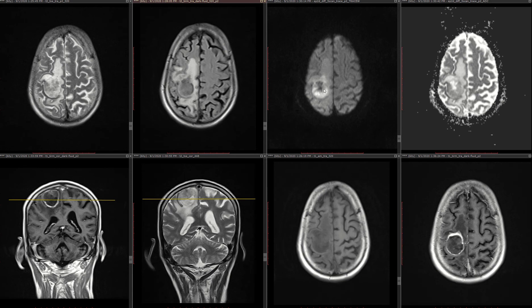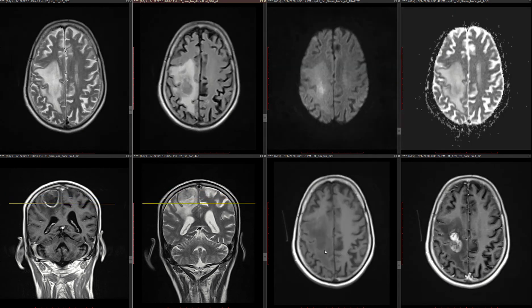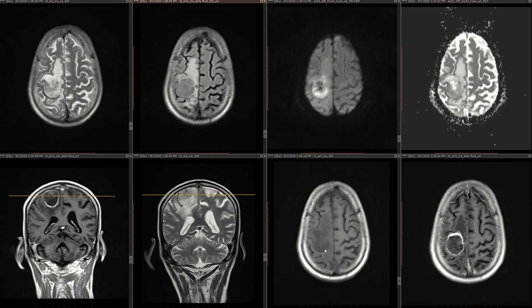However, the lesion itself is peripherally restricting, with some internal part. The central part is not showing any restriction of diffusion. On FLAIR, it is again hypointense. On T1, it is hypoisointense.